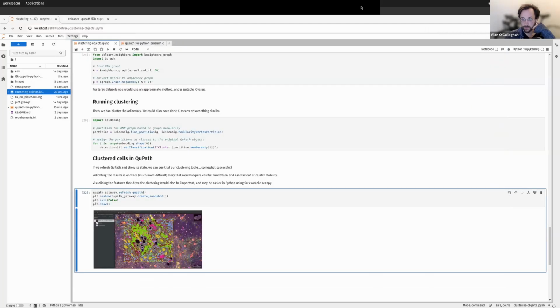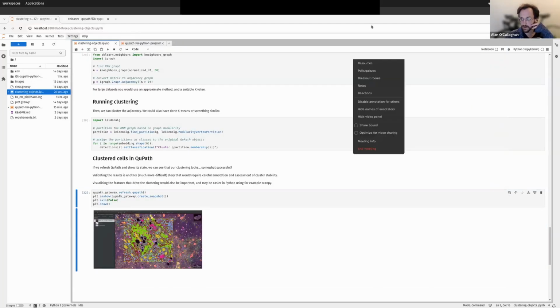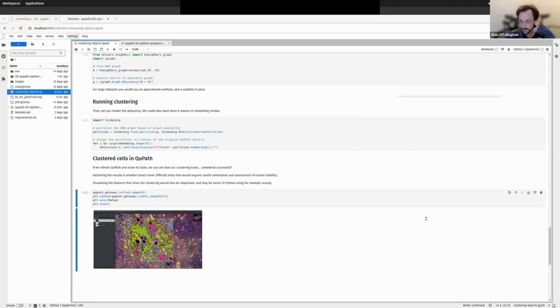Cool. So I'm going to open the chat now. I've gone through all of the material I was hoping to go through. So Pete, as usual, is able to answer what I wasn't regarding the image entries and projects.